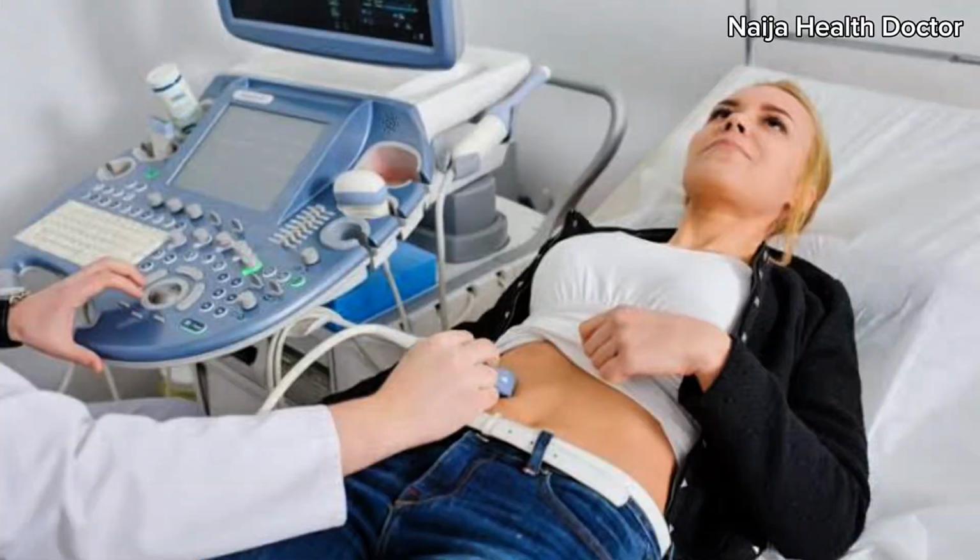So there are some procedures for this scan. It's not that you just come out to do scan. Like pelvic scan now, you have to come with your bladder full. So the bladder makes the uterus transparent so you can see through the uterus. But for obstetric scan, since the amniotic fluid is there, there is no need for your bladder being full. For transvaginal scan, it's not compulsory your bladder is full.